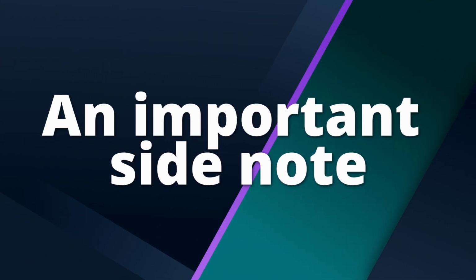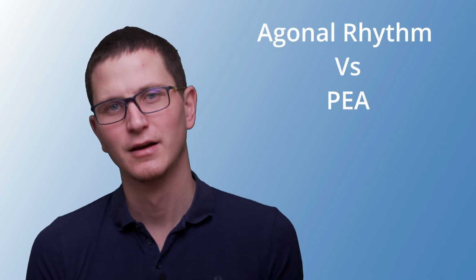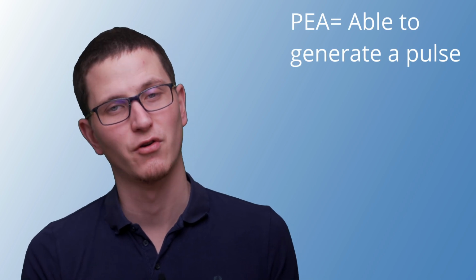The other distinguishing factor that's quite important to mention is that you get these agonal rhythms and you get PEA, right? So what is the difference between an agonal rhythm and a PEA? So a PEA really is defined by a rhythm that could generate a pulse, but isn't. So if you have a P wave and a QRS and a T wave at whatever speed, because you can get slow PEAs and fast PEAs, that would kind of mean that that is a rhythm that could generate a pulse.